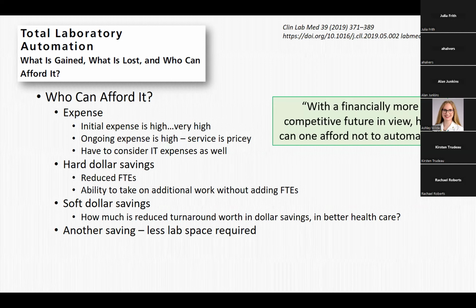Thompson's recommendation, especially when you're talking about laboratories that are combining, large laboratories that cover several hospitals, with all that's going on here, it's not a question of can you afford it or not, but can you afford not to do it? I don't expect to see these in small community hospitals, but there's an awful lot of small community hospitals that are not doing their own microbiology anymore.